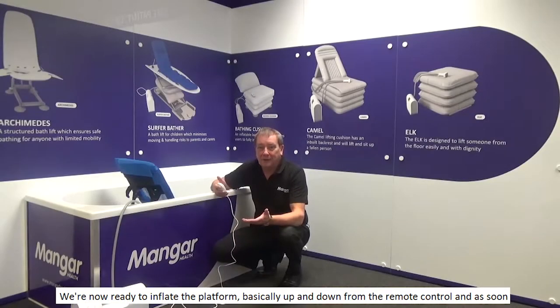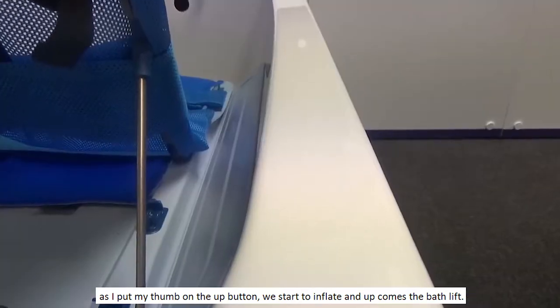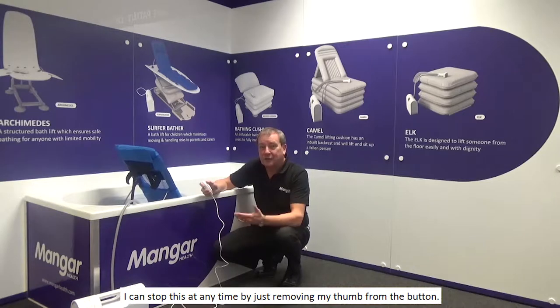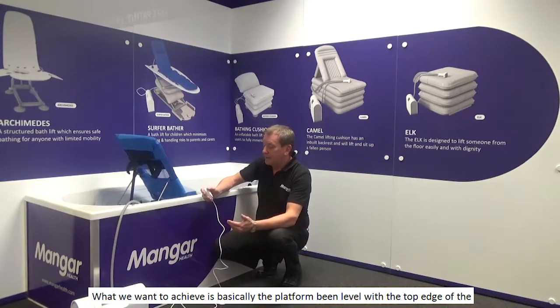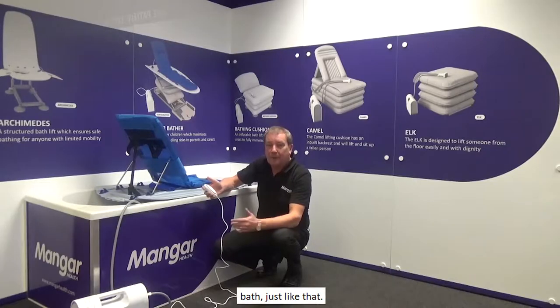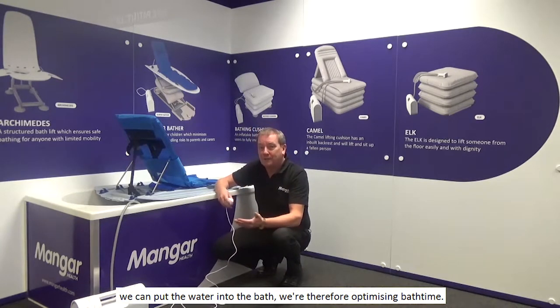We're now ready to inflate the platform — up and down from the remote control. As soon as I put my thumb on the up button, we start to inflate and up comes the bath lift. I can stop this at any time by just removing my thumb from the button. What we want to achieve is the platform being level with the top edge of the bath. Please also note that as soon as we start to get to the position ready to inflate the bath lift, we can put the water into the bath, thereby optimising bath time.